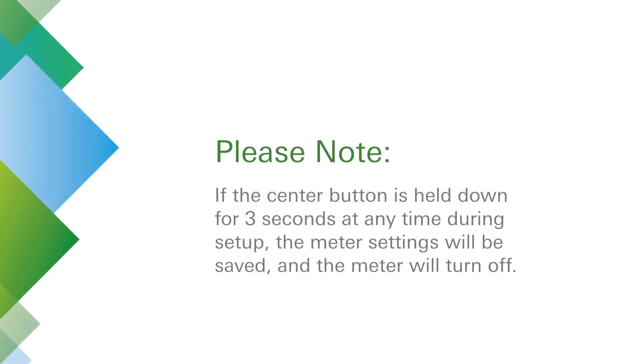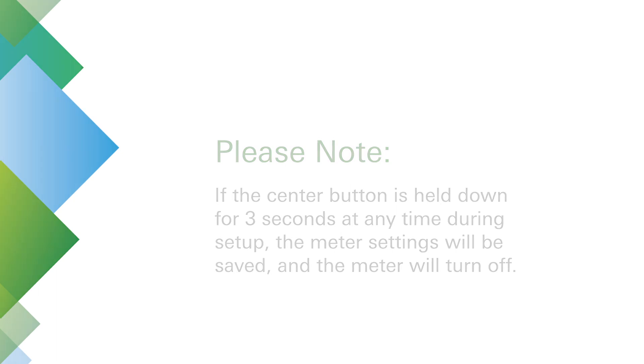If the center button is held down for 3 seconds at any time during setup, the meter settings entered will be saved and the meter will turn off.